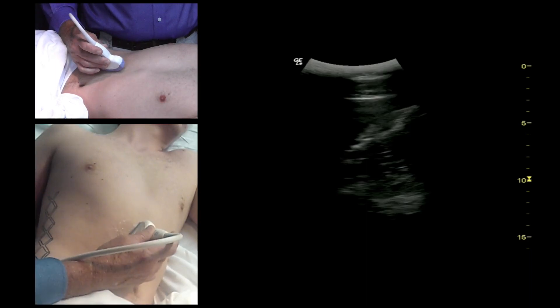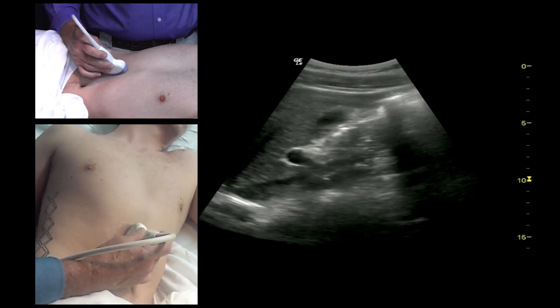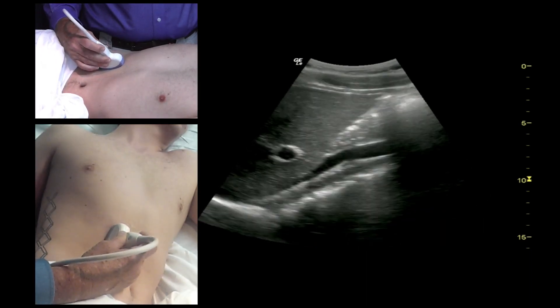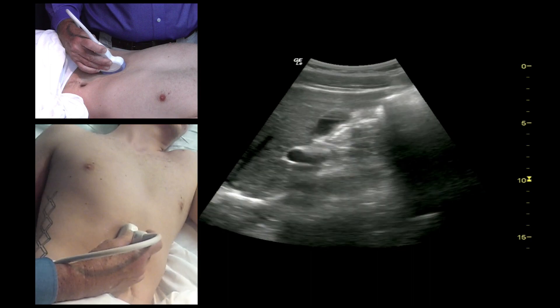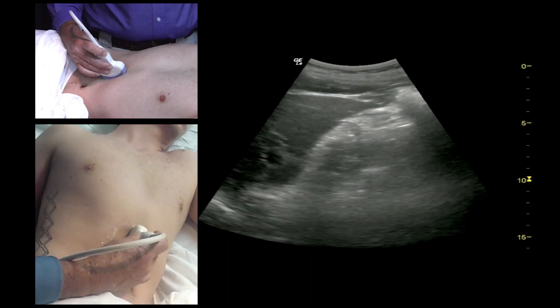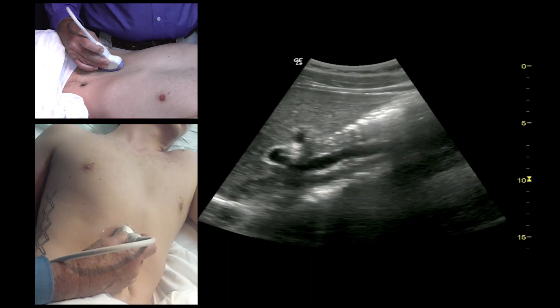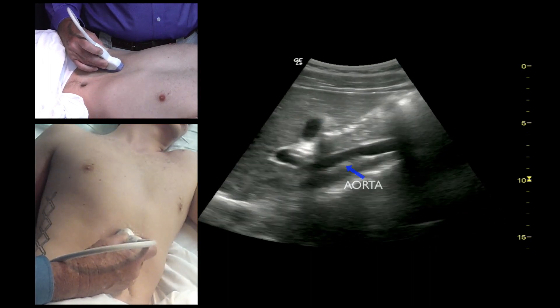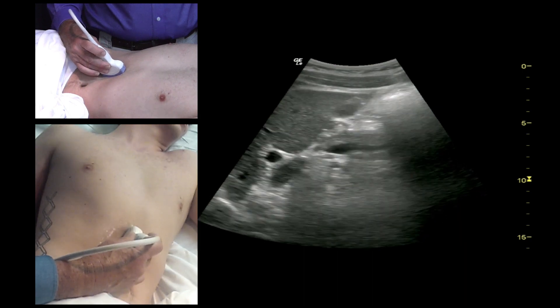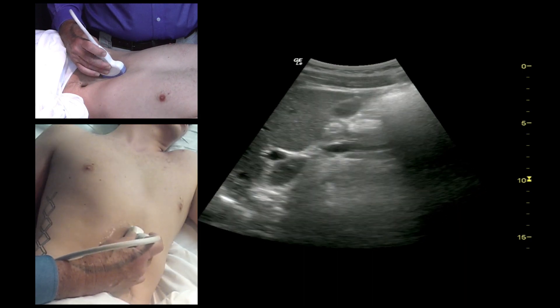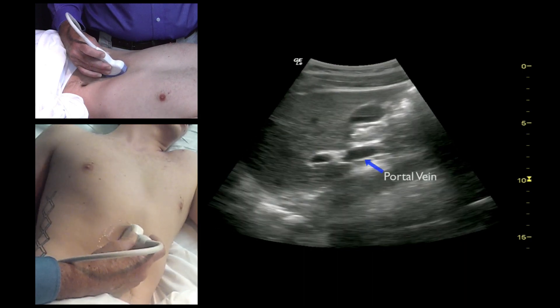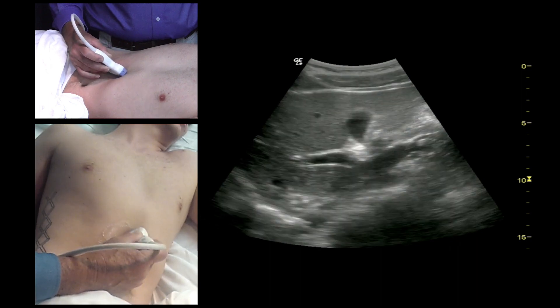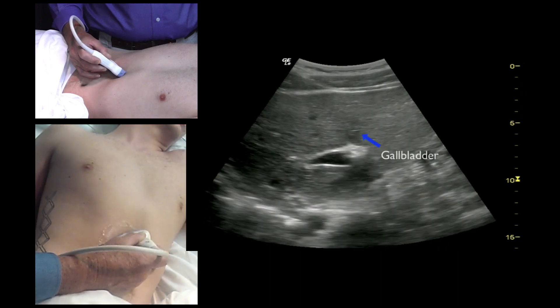When you want to find the gallbladder, position your probe over the middle of the abdomen. You can slide back and forth underneath the ribs to find the gallbladder. Here you'll see the aorta, a picture of the portal vein, and the gallbladder coming down from the bottom.